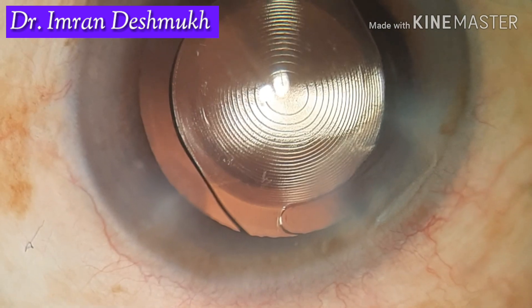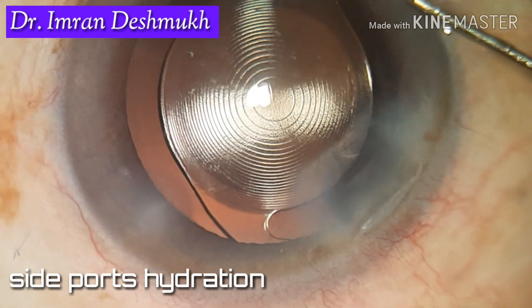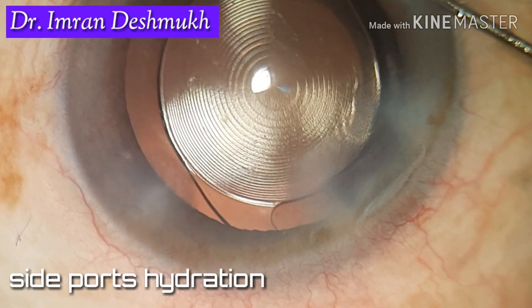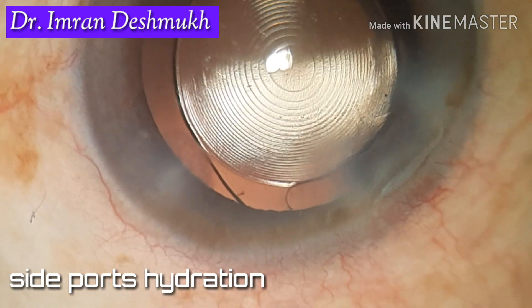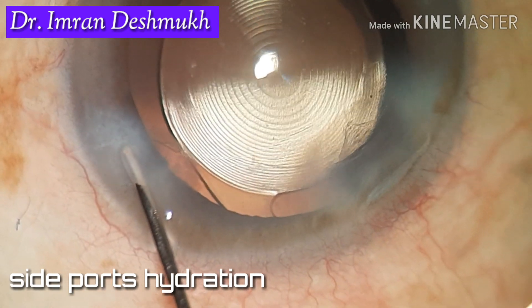After removing the IA probe, with the help of a 27-gauge disposable cannula, you can slowly hydrate the side ports. After hydrating one port, go to the other side and hydrate the other port.